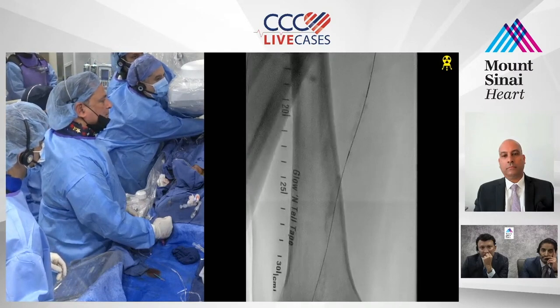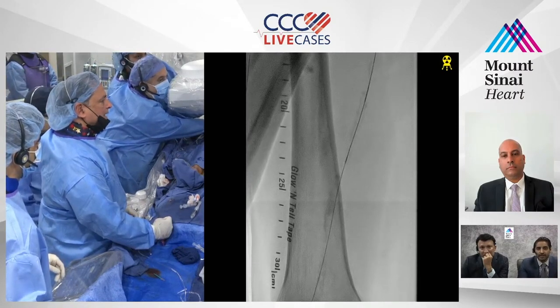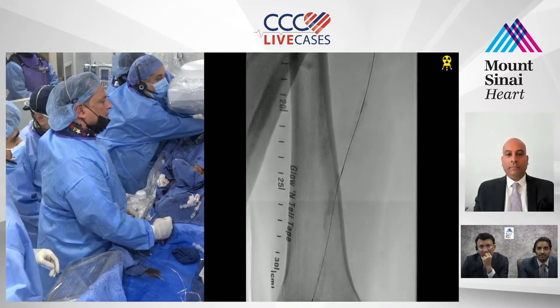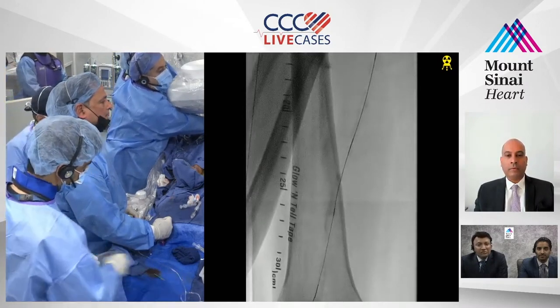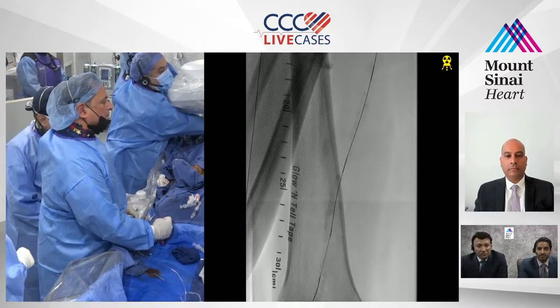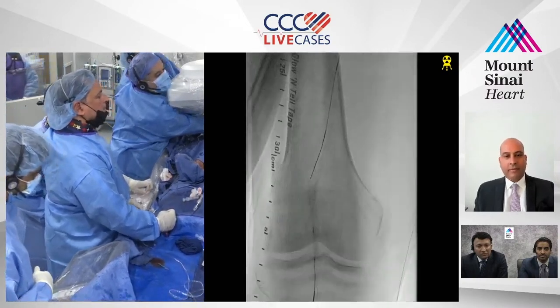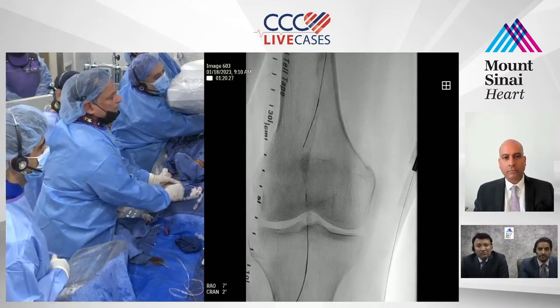Even a little lower would be nice. Maybe just make a small nick in the skin. It's just the... Open the track a little bit. Just the panus. But remember, at the same time, when we keep pushing, we don't want to kink the wire, otherwise we'll be shot. All right, we're almost there. Should we advance wire or keep going? Hold on, let me try to advance the wire here. Okay. Laura, Ray.